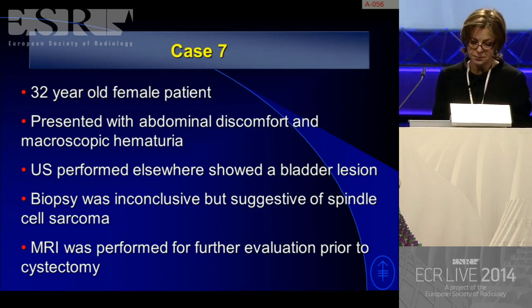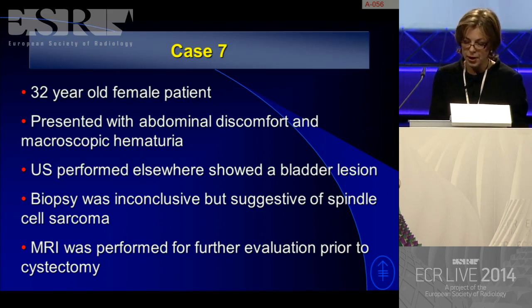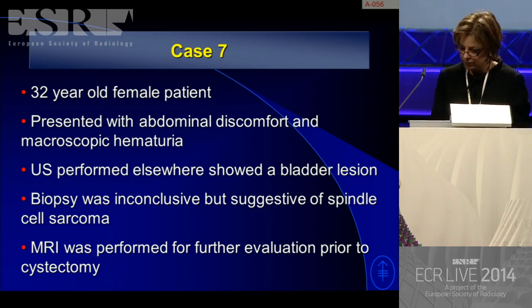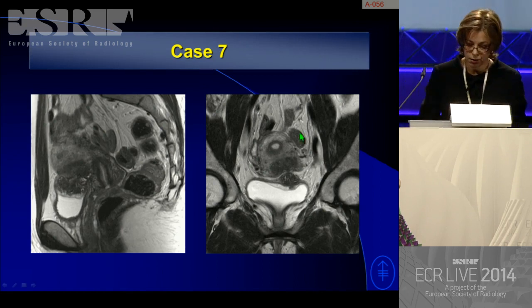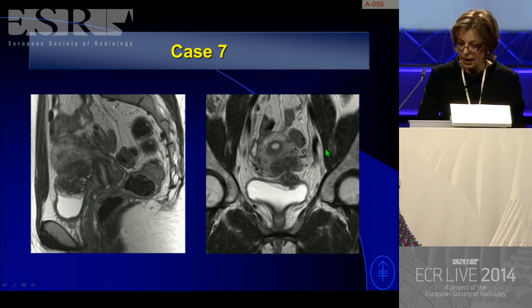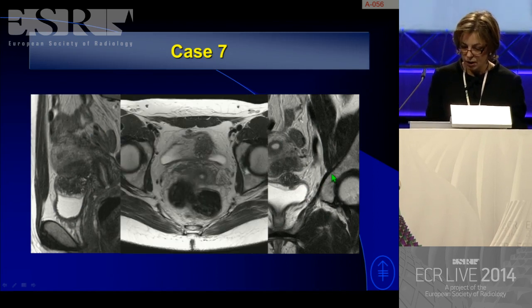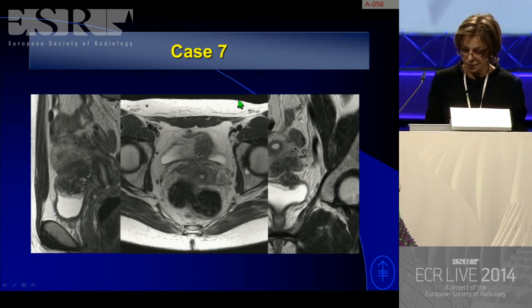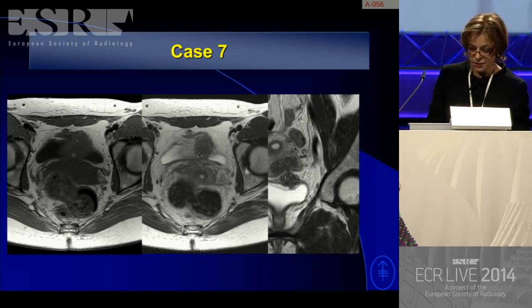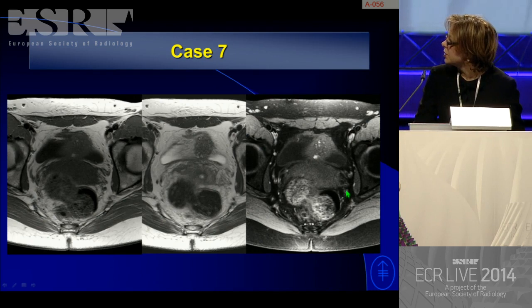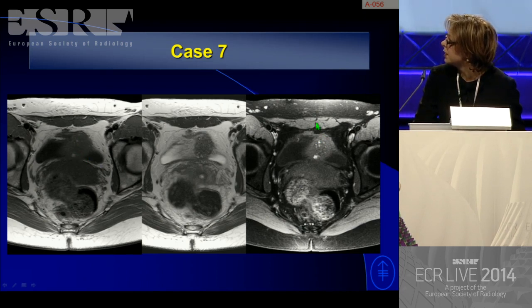Ultrasound showed a bladder lesion; biopsy was inconclusive but suggestive of spindle cell sarcoma. MRI was performed for further evaluation prior to possible cystectomy. On sagittal imaging, we see the uterus, cervix, bladder, and the lesion in question. On T1-weighted images with fat suppression, there are punctate small areas of high signal intensity within the lesion that are barely visible without fat suppression but become clear with fat suppression. The edema of the mucosa is again visible — it is lifted away.